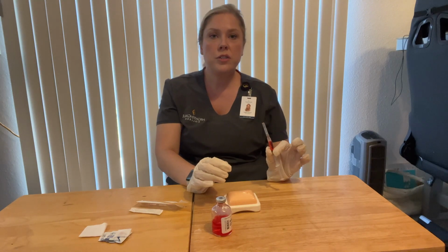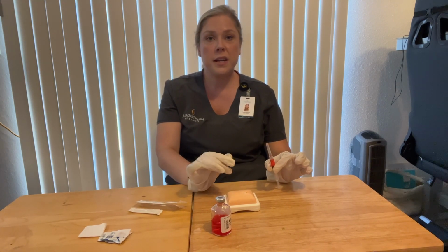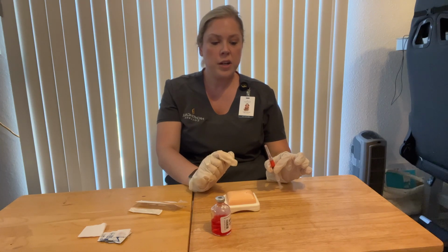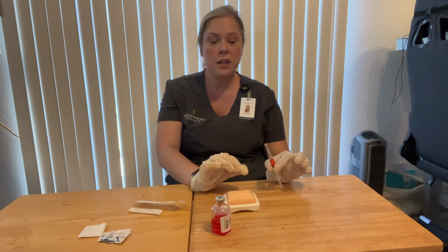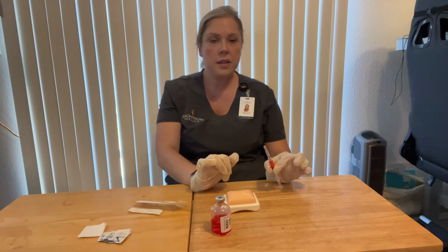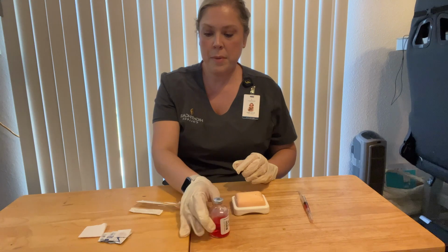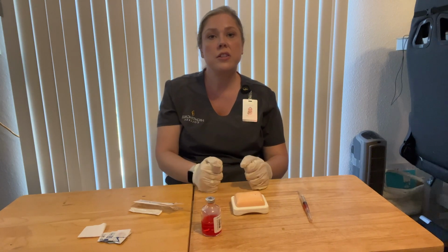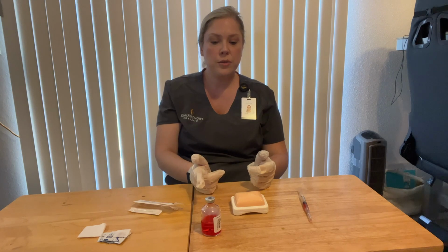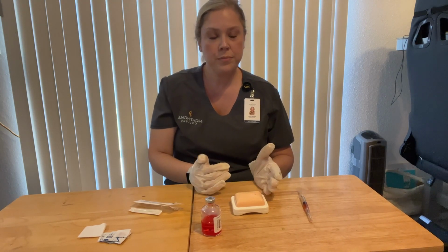If I were to withdraw the medication anywhere else besides next to the patient, I'd want to label my syringe with the correct medication and dose on it, and then bring it to the patient. Since we're doing intramuscular injection, I would want to have the patient lay supine or laterally.